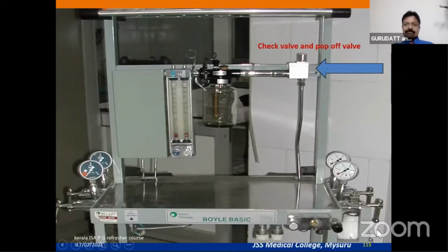So what happens is, if there is an obstruction to the common gas outlet, or whenever I am ventilating the patient with positive pressure ventilation, there is the positive pressure going to the patient and also a back pressure going towards the vaporizers and the flow meters. So in order to prevent that back pressure, and also to prevent the pumping effect and the pressurizing effect that can occur with the vaporizers, we have what is called a check valve.